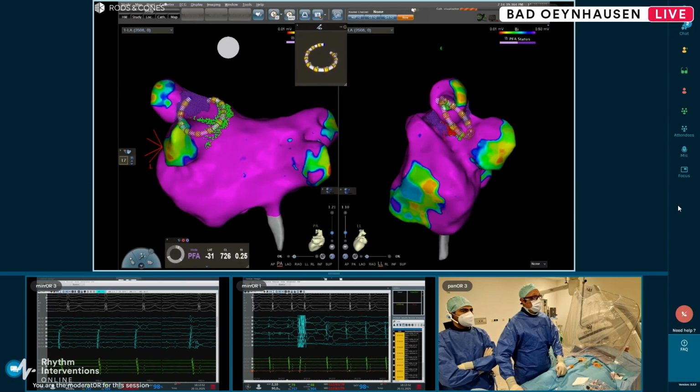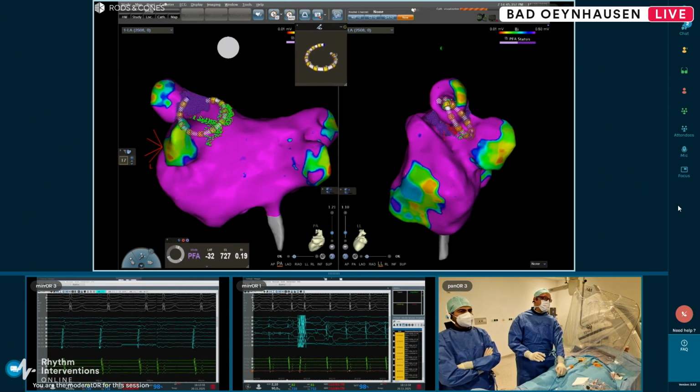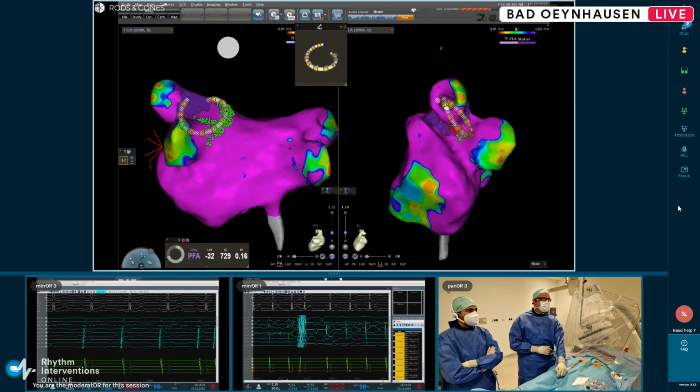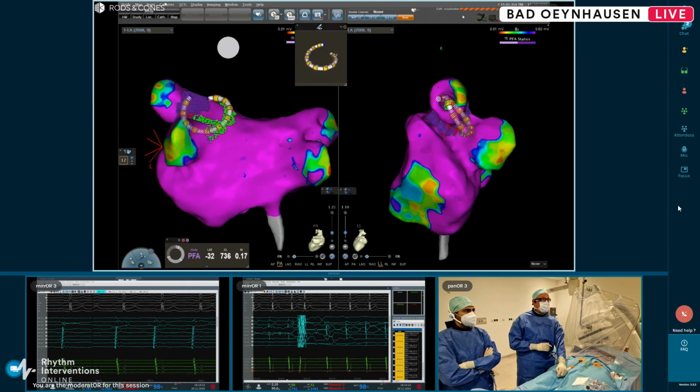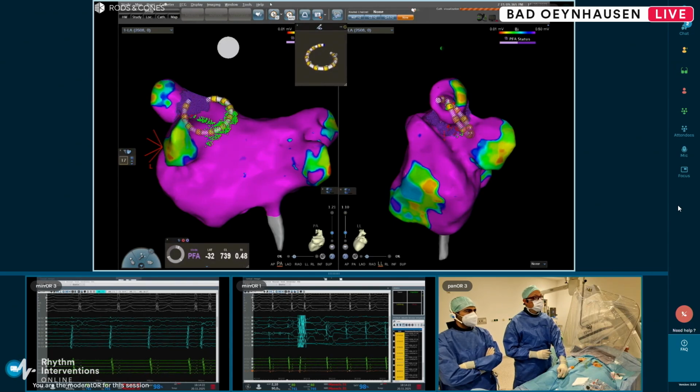So which is now such a position. You see green shows us, and it is clear also for everyone out there that green has no scar so far. So this should be something we can now again target. Maybe we can highlight the bubbles once again, Herr Ertem, which would be helpful. But we need some catheter visualization anyway. You see that green requires ablation, and we see nice signals. So please go on with the next application.